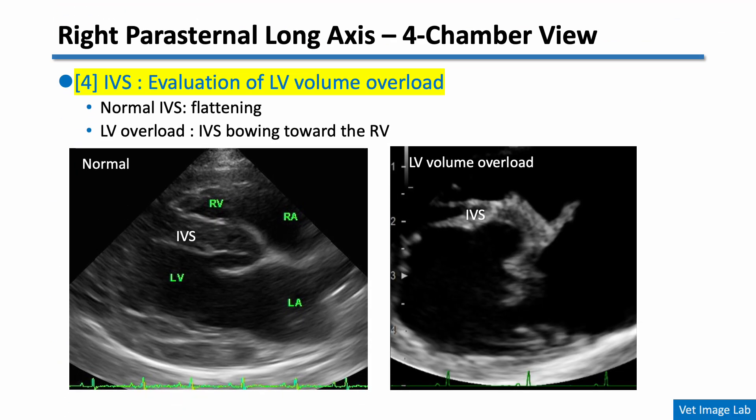Now let's move on to the interventricular septum, or IVS. In a normal heart, the IVS appears relatively flat and straight in the long axis view. But in cases of left ventricular volume overload, like in dogs with mitral regurgitation, you may see the IVS bowing toward the right ventricle.